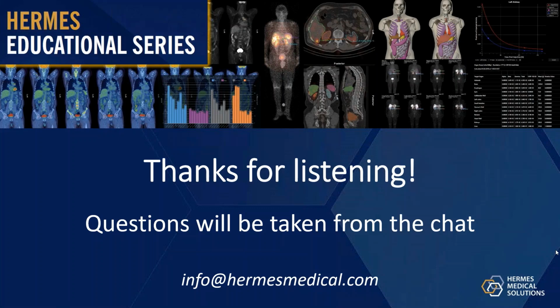Yep. Okay, another question from William Irwin. What sort of post-filtering, if any, is applied? For the Bayesian reconstruction, the basic idea is that the algorithm itself handles the noise, so no post-filtering is needed.